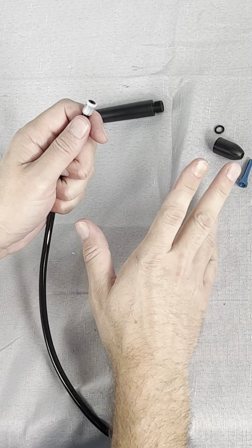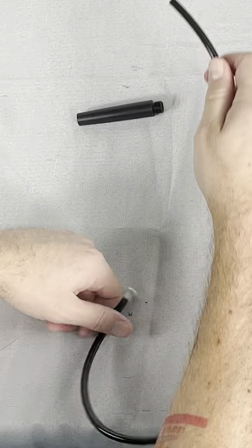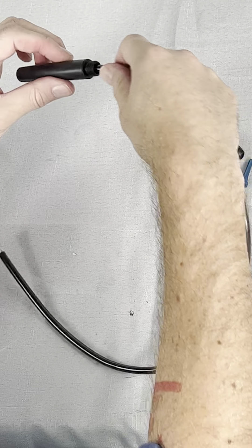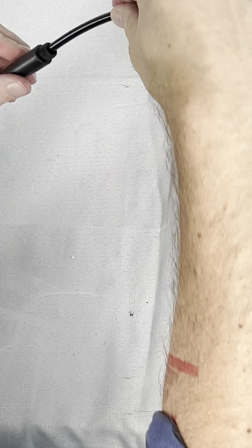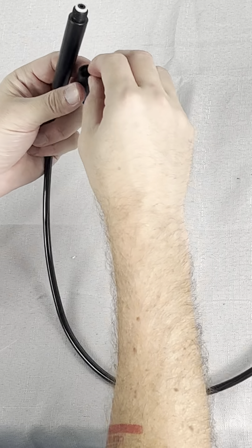You don't want any leaks. It's really important to create a complete seal when you put it all back together. Slip the free end of the tubing back down through the handpiece handle and pull it taut to get that insert back in place. Once it's in, you can put the o-ring, tip, and cap back on.